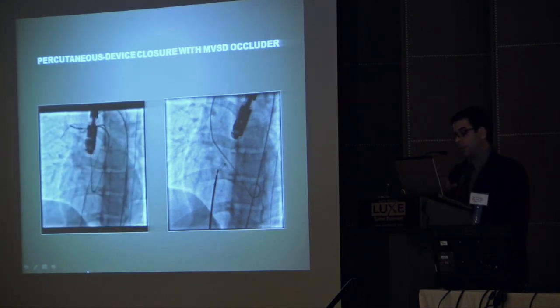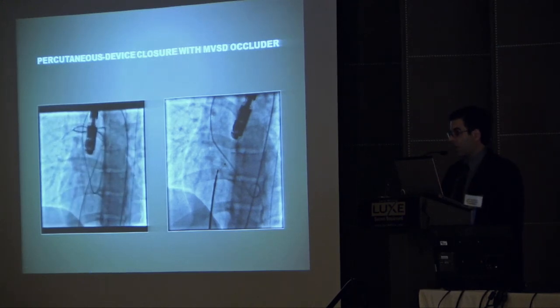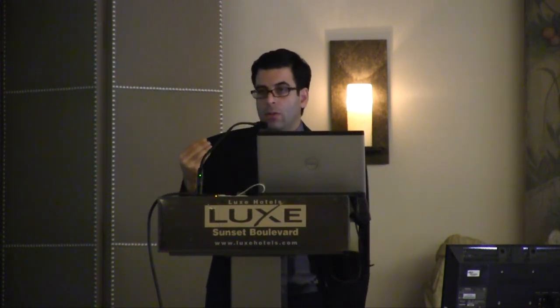It's very important in this case not to actually floss the heart. What you don't want to do is have the wire exposed as it's going through the ventricular septum. You'll cause heart block that way. So you want to be sure that the wire is covered with catheters, and you use a kissing catheter technique, where as you pull one catheter back, you have to advance the other one up. That gives you a strong enough railroad, that wire rail, to put up a large sheath or a guide catheter and then deploy one of these nickel titanium alloy devices.